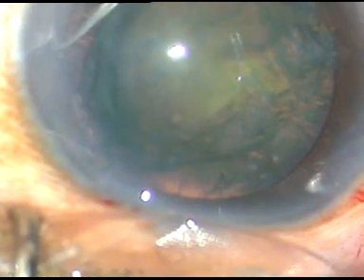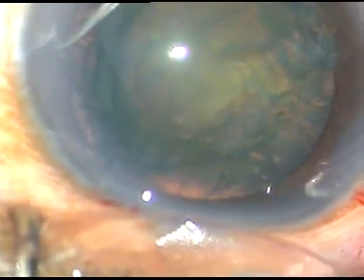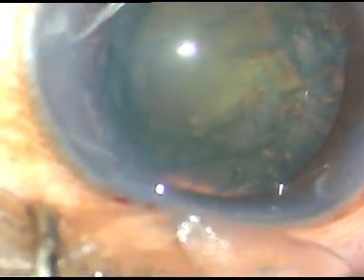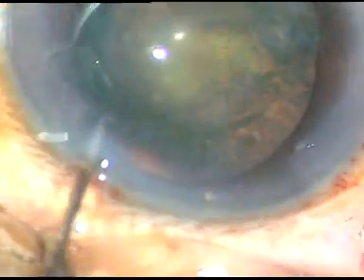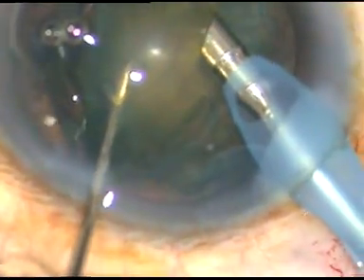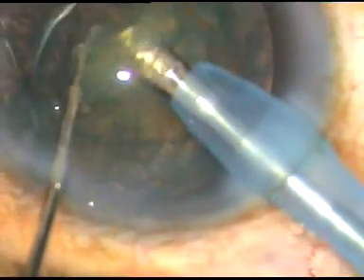Now the tip of the phaco handpiece is introduced with its bevel facing the nuclear mass. The chopper supports the nucleus from the other side, and the supracapsular portion of the nucleus is being emulsified and removed.